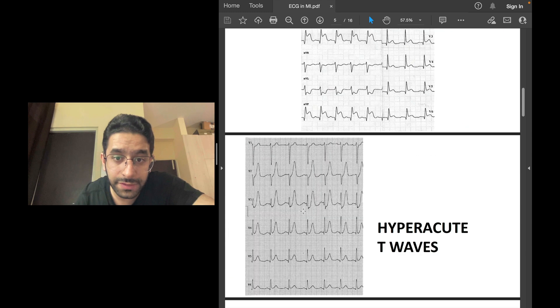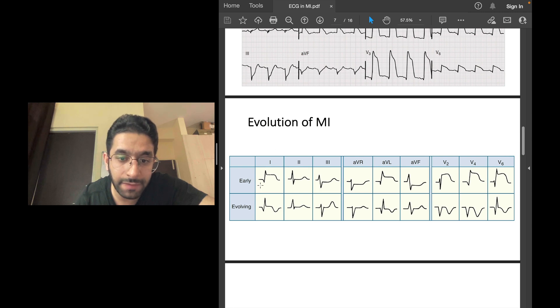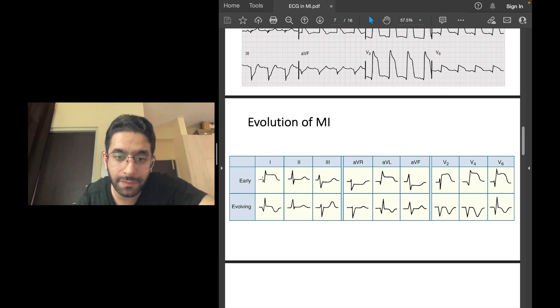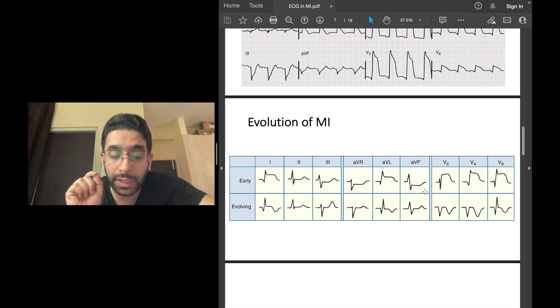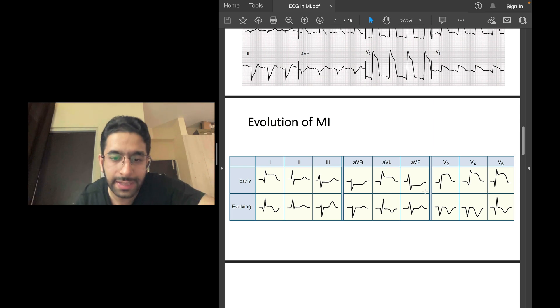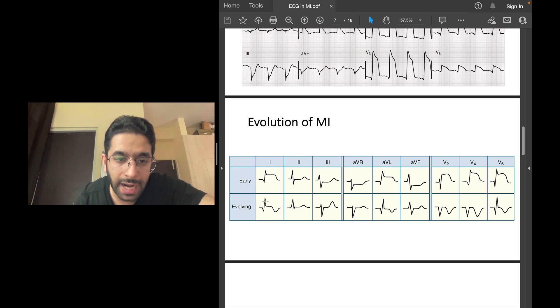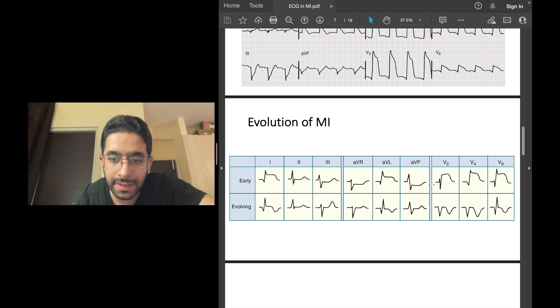This is how an MI evolves. At presentation, you have ST elevation in leads 1, AVL, V2 through V6 — an anterior wall STEMI. Several hours later — say 5, 6, or 10 hours after the chest pain — Q waves start to appear. Notice a QS complex in V2, a QS complex in V4, and a Q wave in V6. Q waves evolve and T waves start to invert.